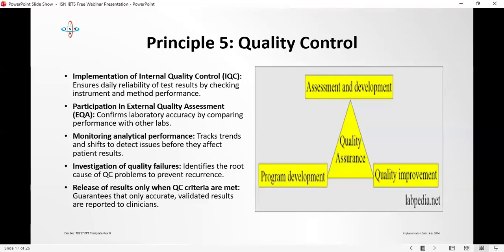Based on CLSI guideline, you need to map your tests in the laboratory based on the risk that they can cause to the patient. There are some tests that are very stable and some tests that are erratic, like alkaline phosphatase, like calcium. You run more controls on them as opposed to some, like enzymatic creatinine, like urea, like glucose. Those, depending on the method or on the instrument, are very, very stable, and no matter what you do, before you observe any aberration of clinical significance, it is very hard.